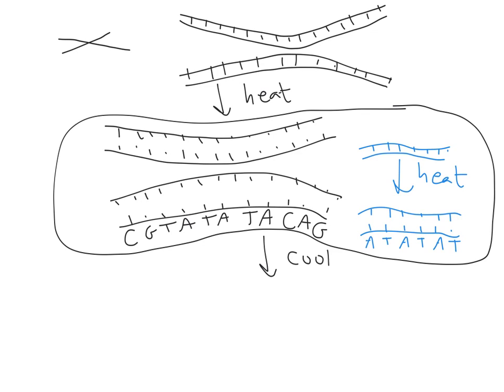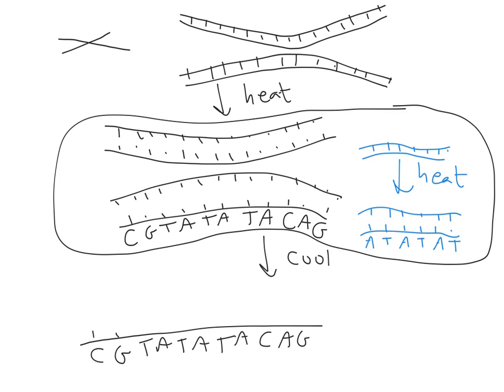And what happens then is that single strand with its sequence, the chromosome that's affixed to a glass slide, is sitting there with all of its hydrogen bonds unsatisfied. And along comes one of these probe sequences that has a complementary sequence to part of the chromosome sequence.